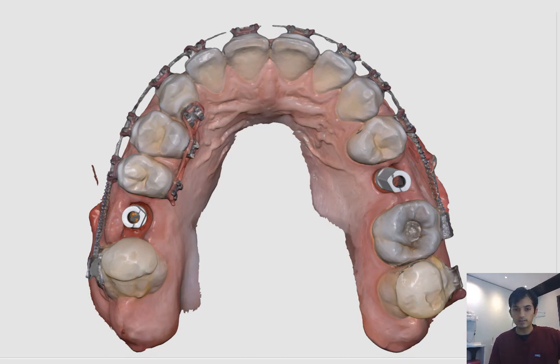Also, ortho teeth tend to have a little bit of mobility to them, and that may also lead to inaccuracies in your contact points. So scanning this case, we didn't have to prepare the patient at all. We could scan it, get the crowns prepared, and deliver them on the day that we were planning to remove the orthodontic appliances without worrying about any potential relapse in the time it takes to make that crown.